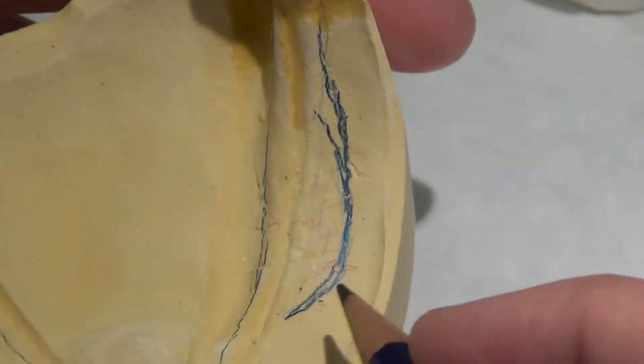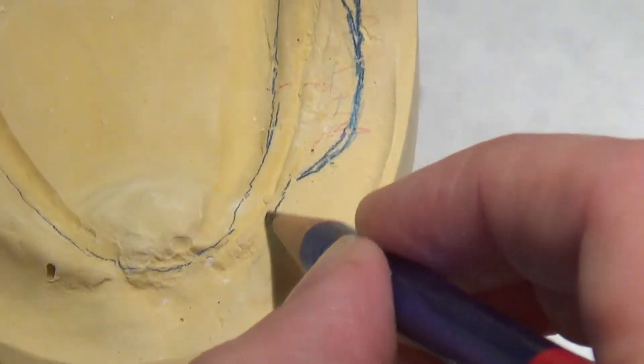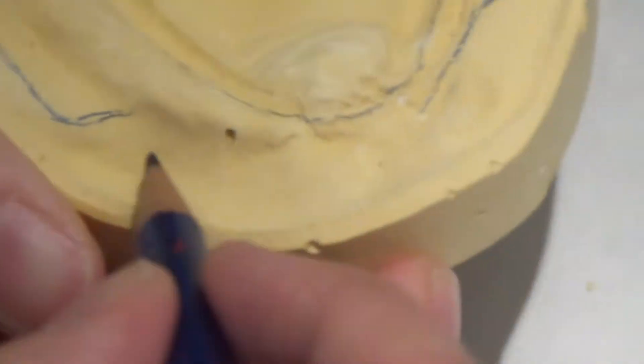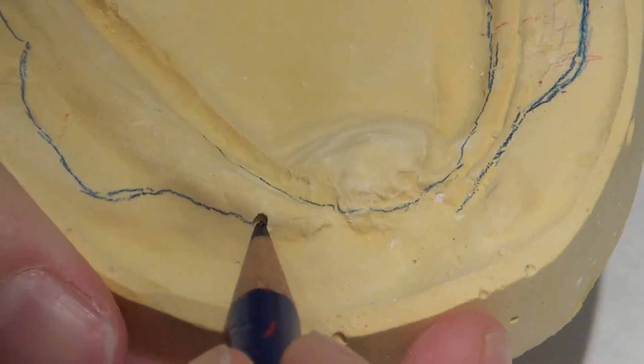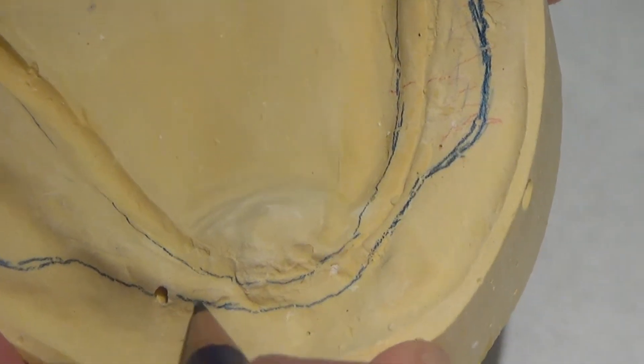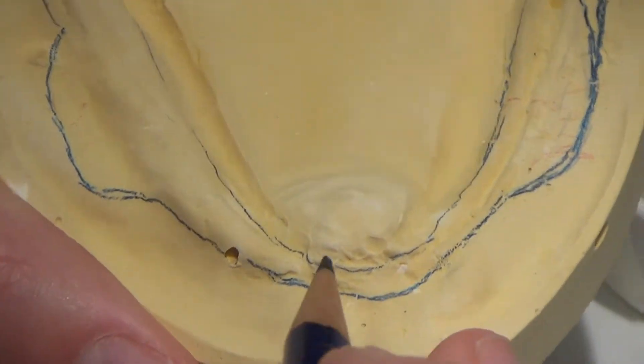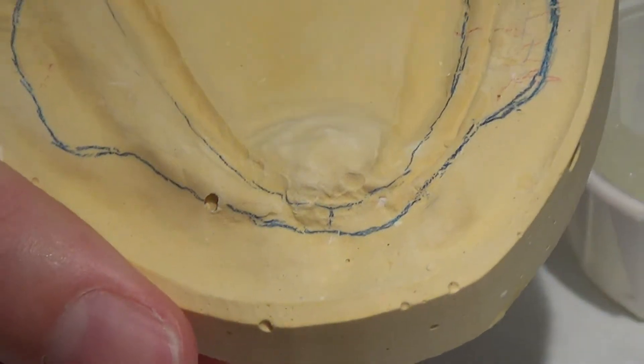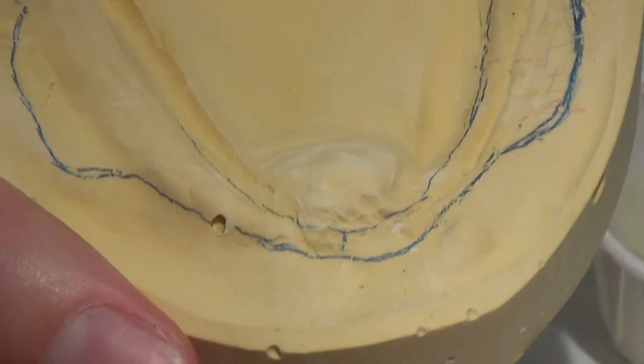I'm going to come down like something like that. In the anterior area, it's going to be super flat and really skinny. So this tray handle is going to require that I make it thick in this area.